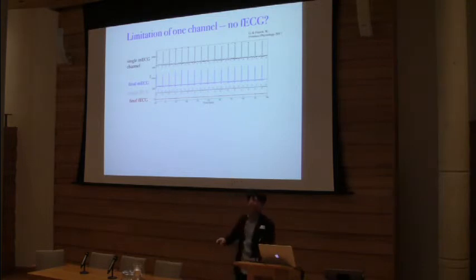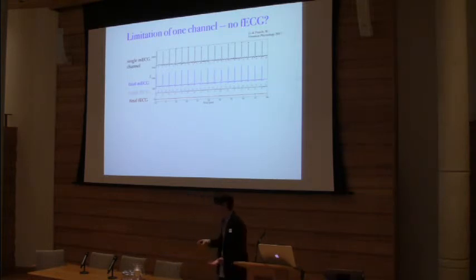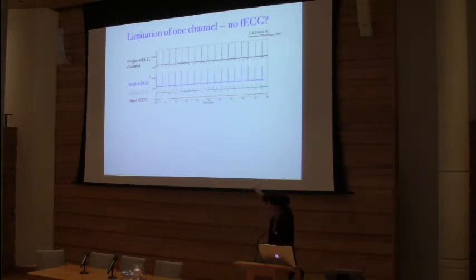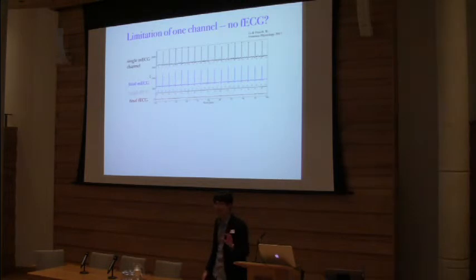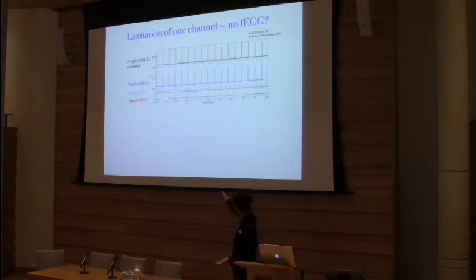So this is 1 lead. You will say, hey, 1 lead, it's just lucky, right? You can get something. But with 1 lead, sometimes it's really impossible. For example, in this case, if you do single channel maternal ECG, there's really no fetal ECG information, just 0. You don't get anything. Then how can you fix it? You cannot fix it. You don't have information. What do you expect? So for this kind of signal, we cannot do anything.